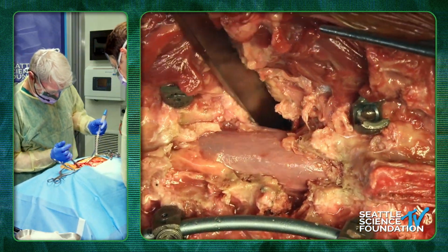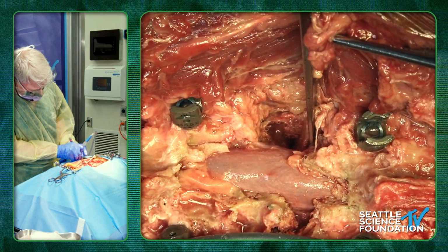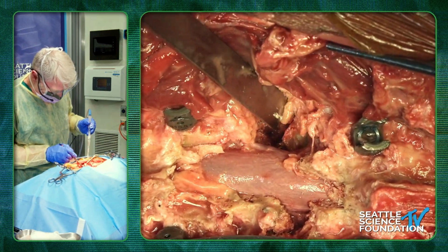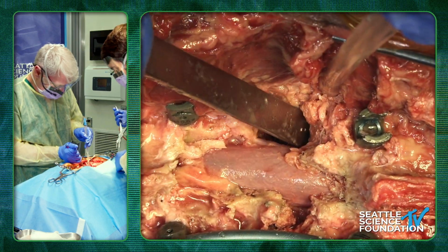And in this case, on a hemi, the next one's going to come through the disc space over here. Hammer. So that's above the pedicle into the disc space, and you can see the end plate, and now here's the top of the vertebra coming out.